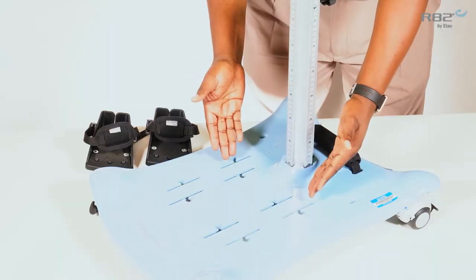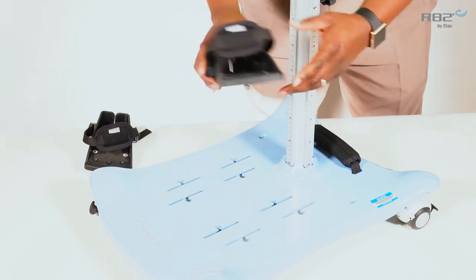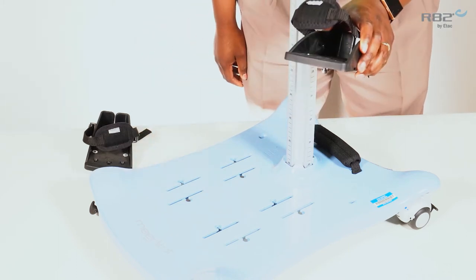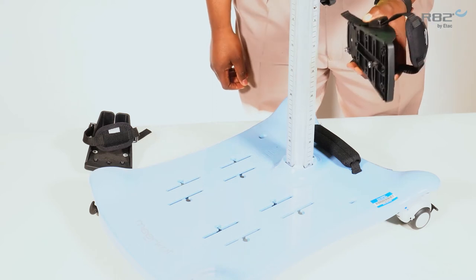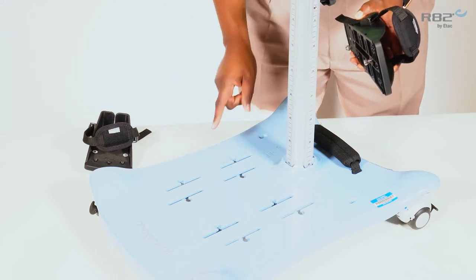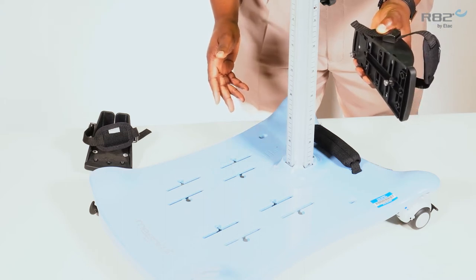The Meerkat base plate will have two sets of tracks. The tracks are used for the sandals. The inner track is used if you desire the user's feet to be closer together, while the outer track can be chosen if you desire the user's feet to be further apart.